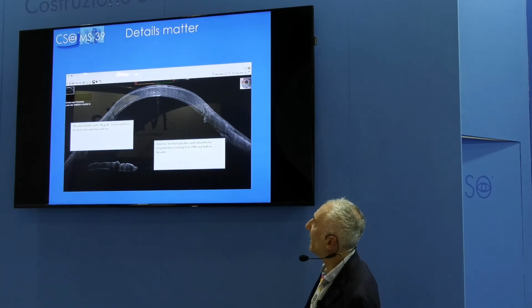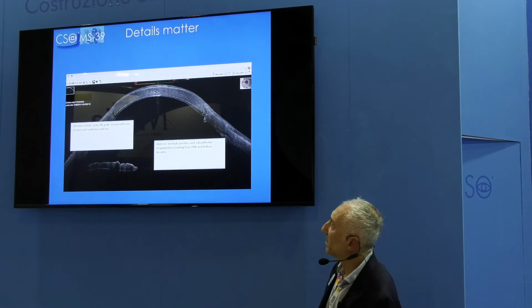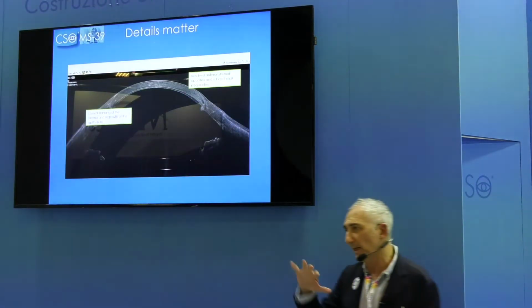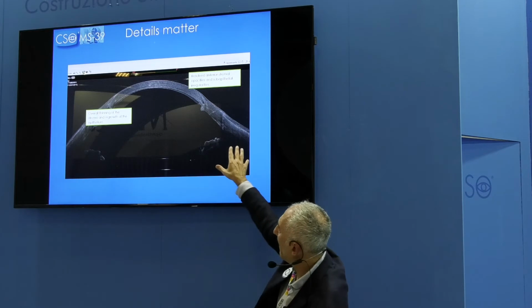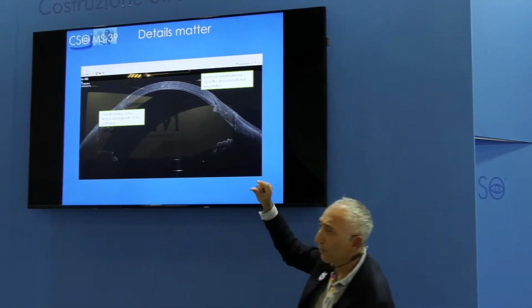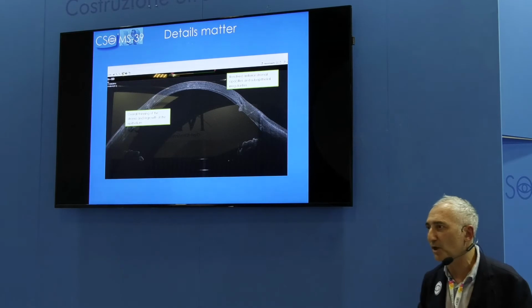And so we had to make a decision because vision was not good in that case. And so we made some, let's say, resurfacing with a custom laser procedure. And we obtained a very regular cornea. And so without the opacities, of course thinner, but the cornea was in a decent shape.